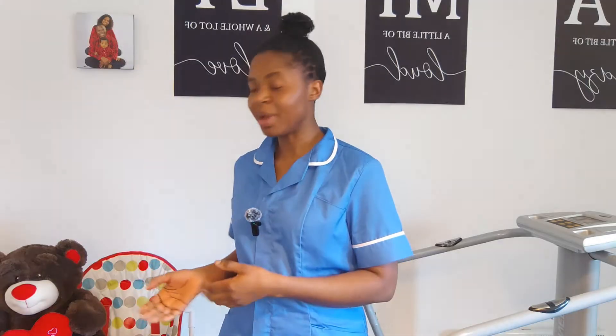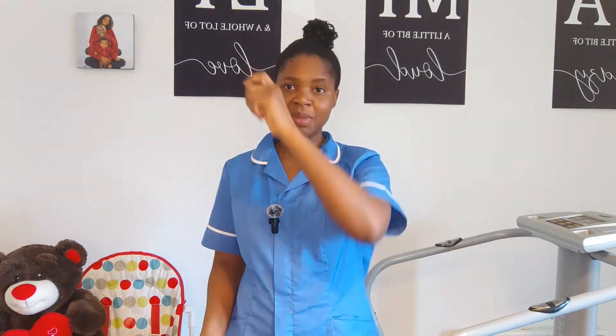As I approach my scene, I confirm it is safe — nothing to harm me or my patients. I provide privacy by pulling the nearby curtain. I go ahead to perform my hand hygiene following the seven steps of WHO standard: palm to palm, right palm over left and vice versa, fingers interlaced, fingers interlocked, rotational rubbing of the thumb, fingers, and wrist — both sides. My hands are clean and I allow them to dry for 30 seconds.